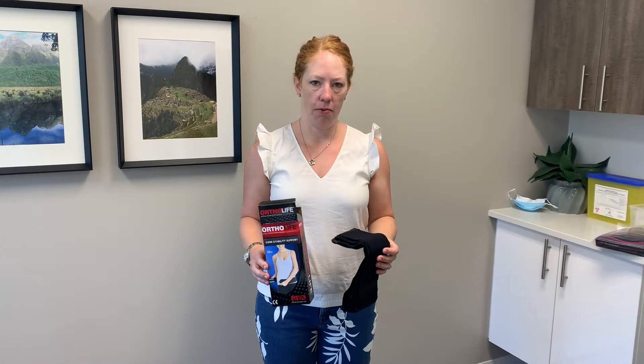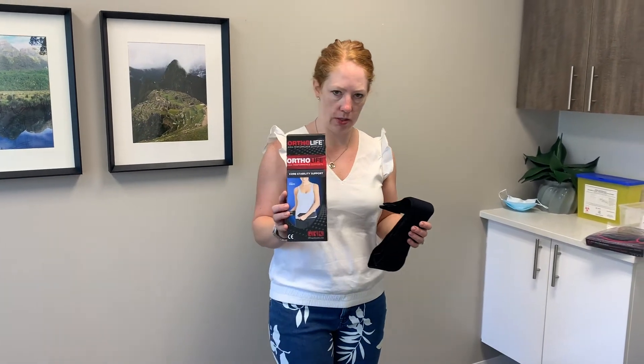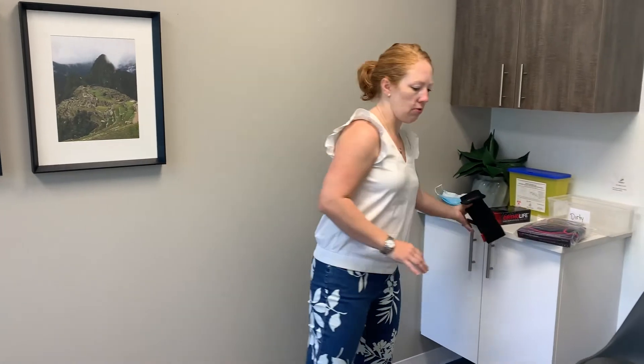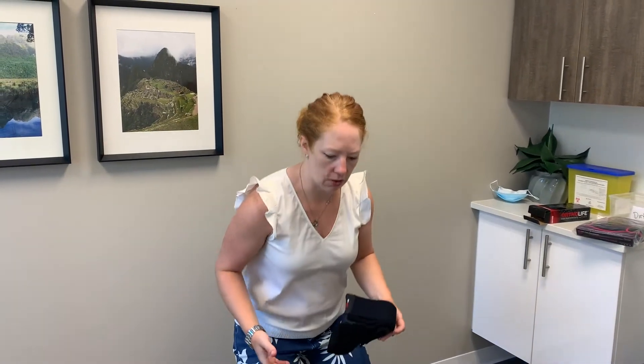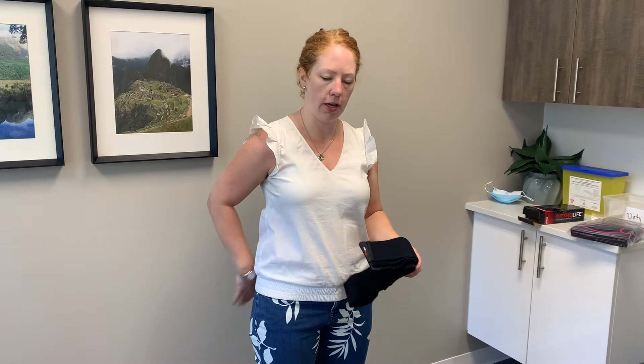We're going to talk a little bit about sacroiliac belts, or SI belts as most people know them. We carry some in clinic — this is one of the ones that we carry. It's used mostly if you've got pelvic pain, back pain, if you're pregnant, postpartum, or any time in life where you're having difficulty in the low sacrum. You might have difficulty walking or get low back pain when squatting.